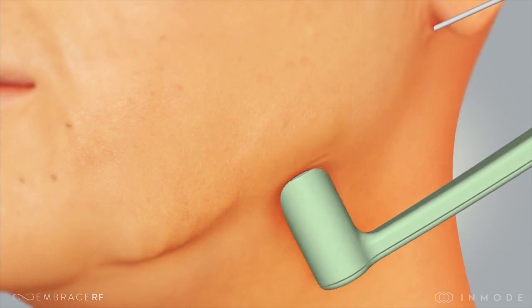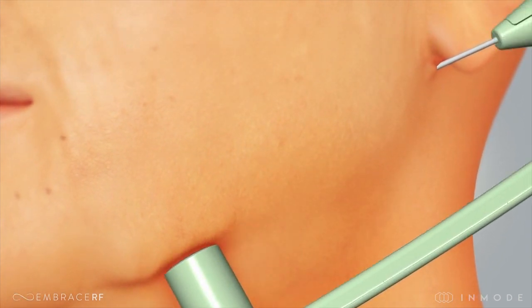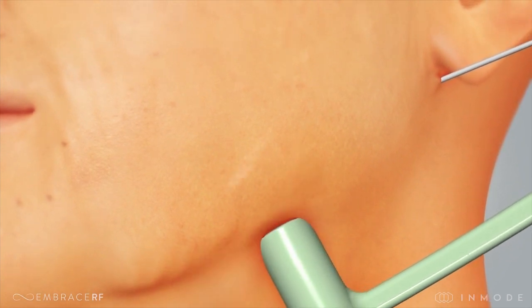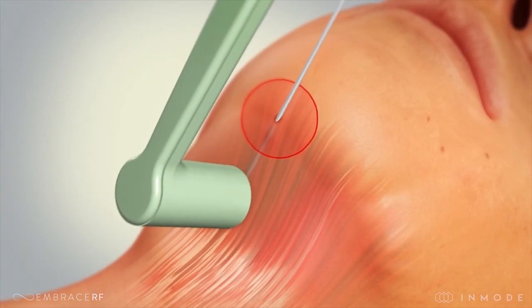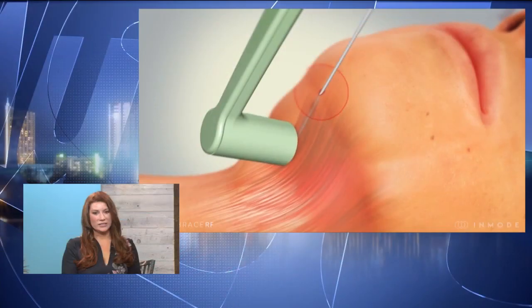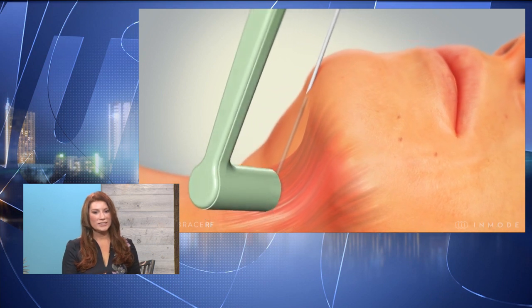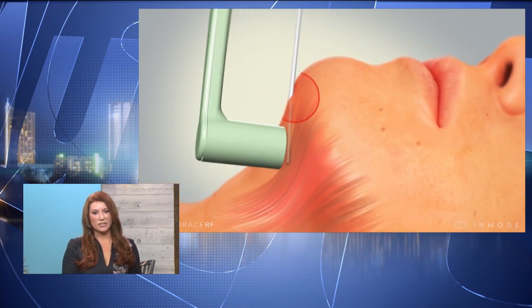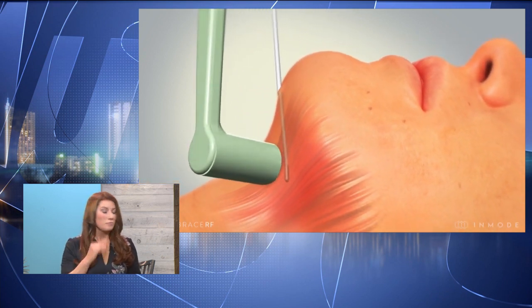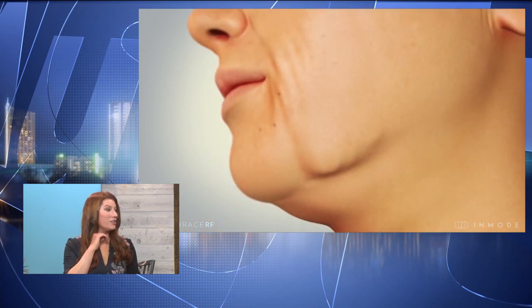What exactly are we looking at? So the first step of the Embrace RF procedure is using FaceTight, and you can see the device working in this video, and it involves a component that goes under the skin and a component that goes over the skin. And there's heat energy that's delivered in between those two components. And so afterwards, over approximately a year, the skin will continue to tighten and the fat underneath the skin will melt.